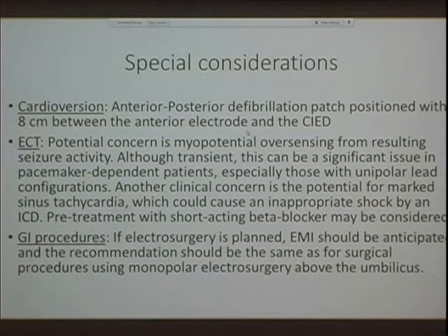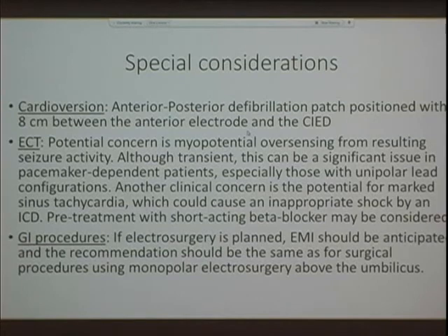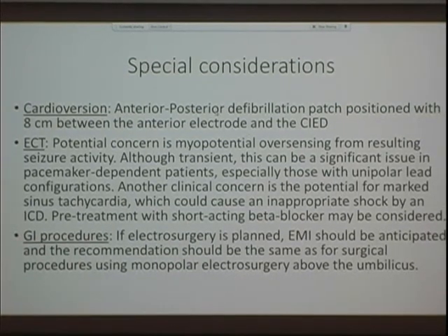Special situations where pacemaker or defibrillators would have to be dealt with slightly differently. If the patient needs a cardioversion and has a pacemaker, an antero-posterior defibrillation patch location is better than an anterolateral. It causes less current affecting the defibrillator because the current in this field is smaller versus the current in this anterolateral projection for a pacemaker. So AP position is preferred in patients who have cardiac implantable devices who need defibrillation.